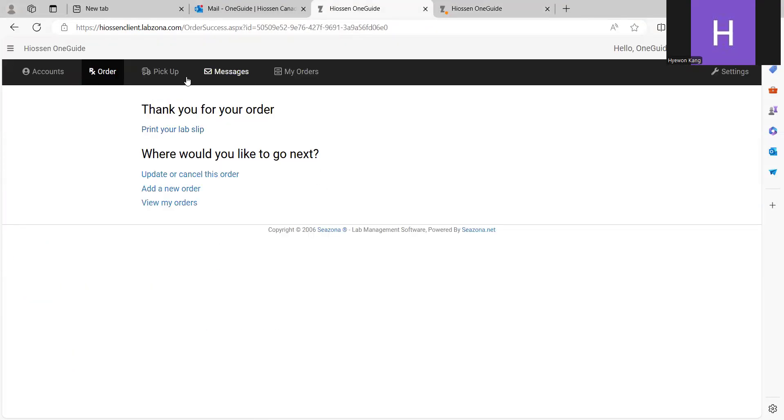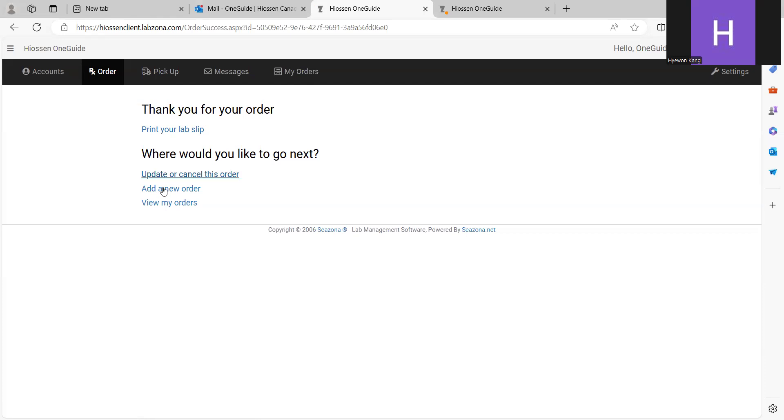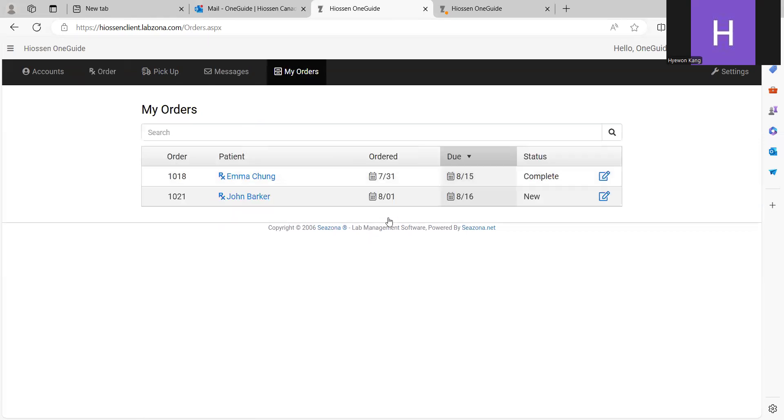And if you want to see all the cases you created, you can click view my order here, or go to the my order menu on the top menu. As you can see, you can also check your status here.